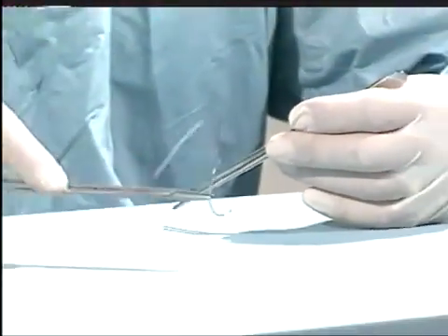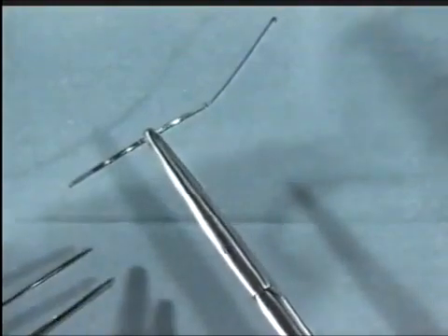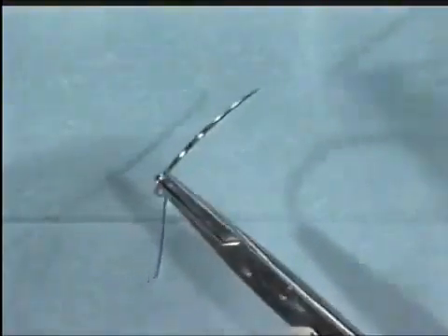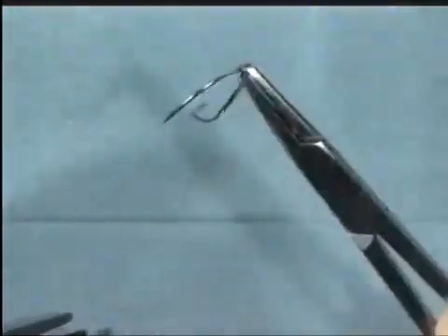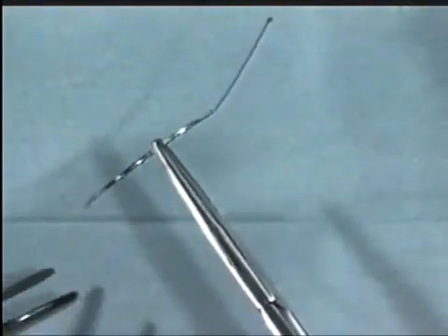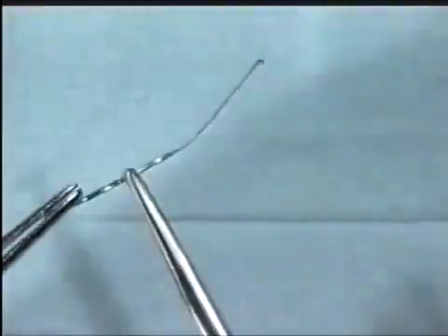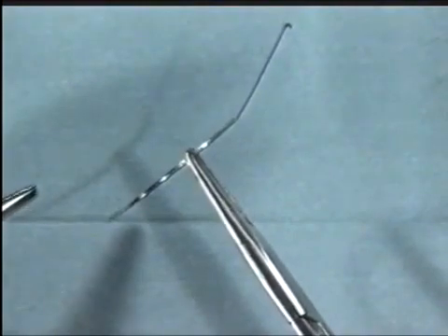Insertion of sutures requires a smooth supination of the forearm. Occasionally a backhanded suture is required, in which case the needle position can be changed in the needle holder, enabling you to insert a backhand suture. To practice this change of position, grasp the needle with the forceps, and then by supinating one forearm and pronating the other forearm, the position can be changed quite easily by just releasing gently the jaws of the needle holder.